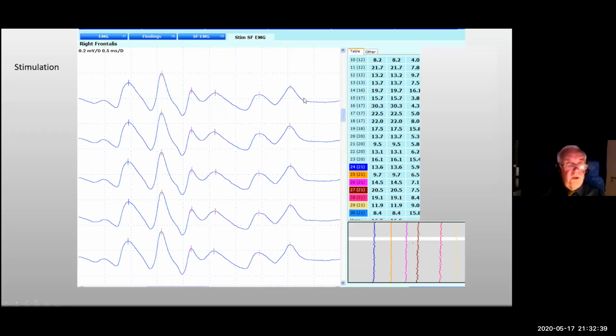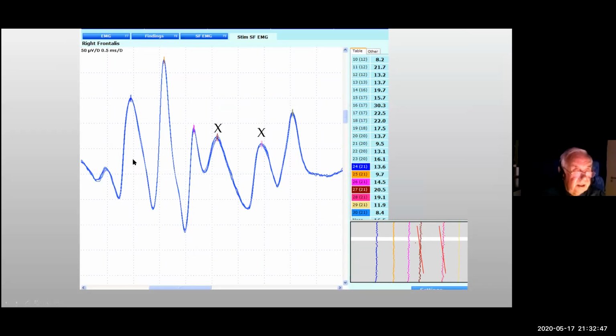Here's another, it looks fine. This is sharp and nice, sharp and nice. And when you look at the first one here, you see that it is not parallel, so these are not so good. And when we look at details here, this one should not be accepted either. But the others are very nice here.